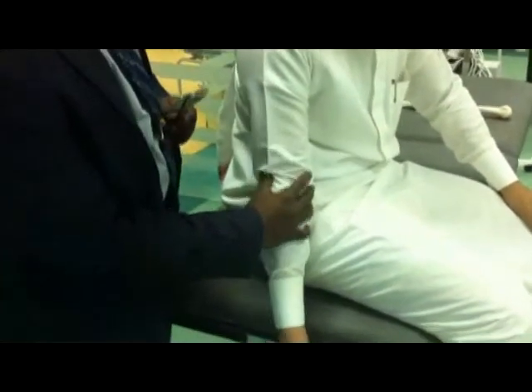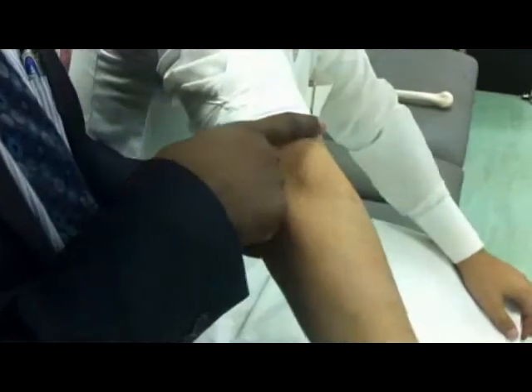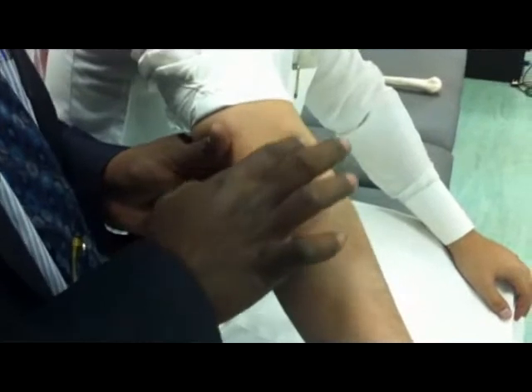The hand should be in the supinated position — neither pronation nor mid-prone, it should be supinated — then you will do elbow flexion. How to palpate the lateral epicondyle? If you see the bulge on the lateral side, this is the depression — go there and palpate. Now I have palpated the lateral epicondyle. I will keep the fulcrum on the lateral epicondyle.